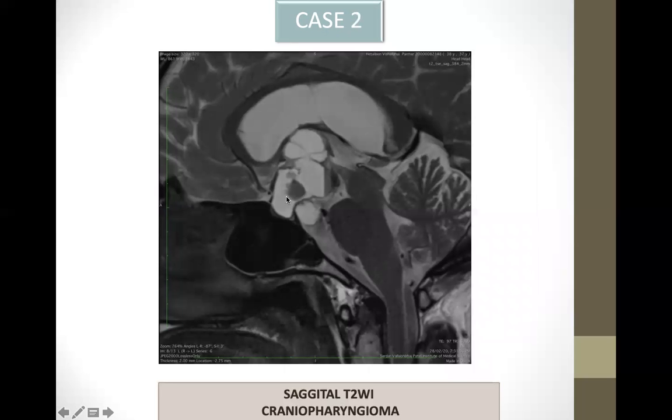This is a case of craniopharyngioma involving the sellar and suprasellar region, and it is predominantly cystic. This is a T2 sagittal weighted image.